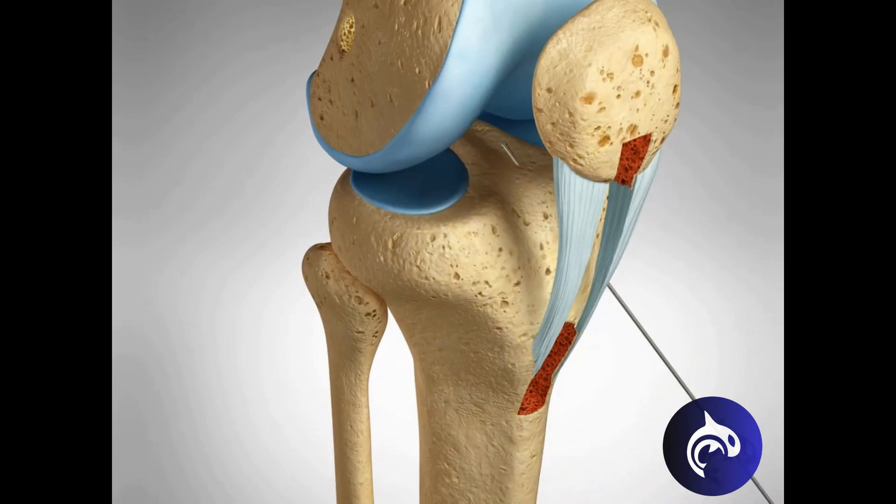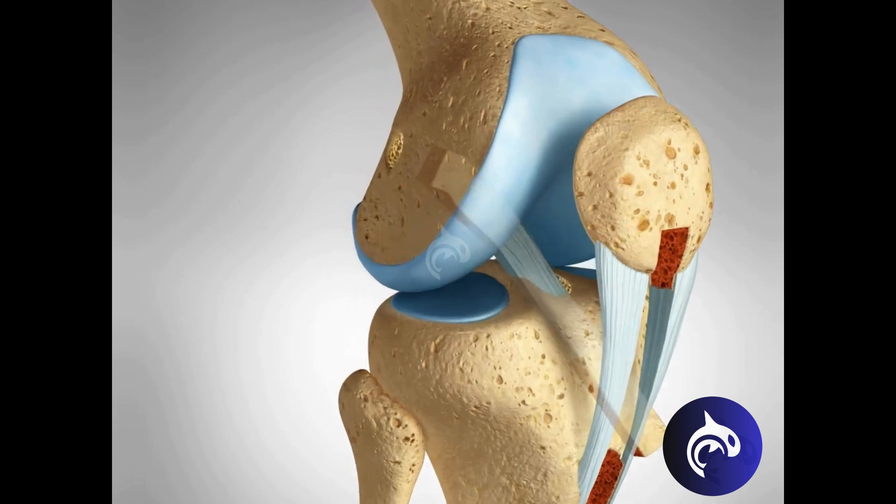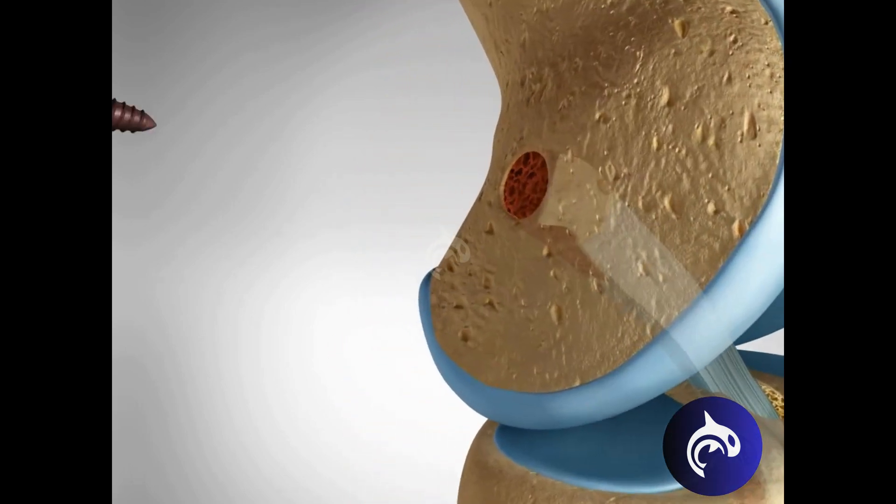The tunnels must align accurately to ensure correct graft positioning and tension. The graft is then threaded through these tunnels, and the bony plugs provide strong fixation. Screws or other fixation devices are used to secure the graft.